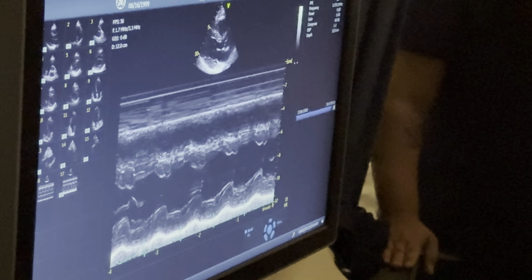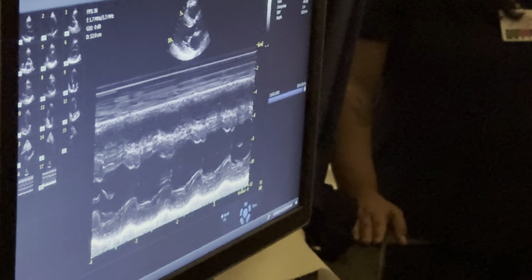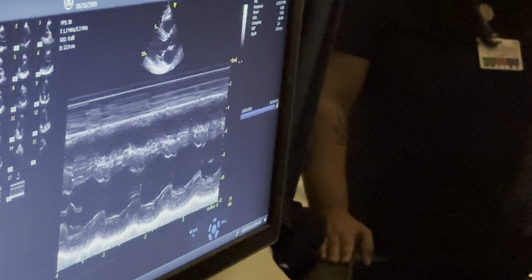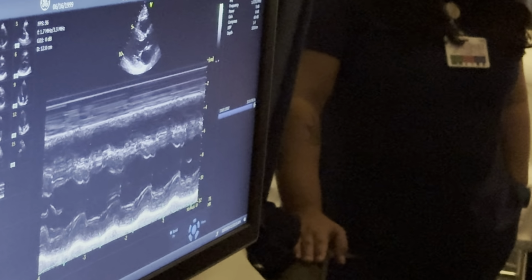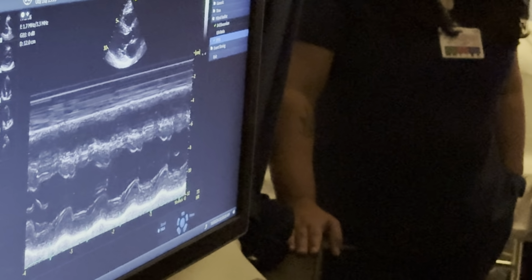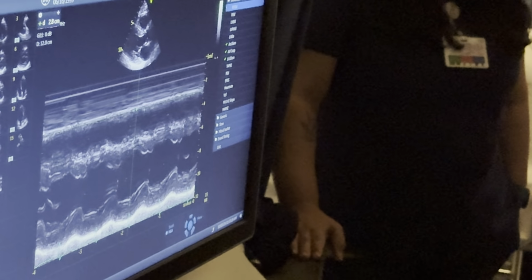That's the other thing that I'm going to be looking for when you are sitting down here, making sure you're not panicking, because the patient doesn't know any different. We want to make sure that we remain calm while we're doing the study. And if we're messing up and not able to get the images, we don't want to let our patient know that. Okay?